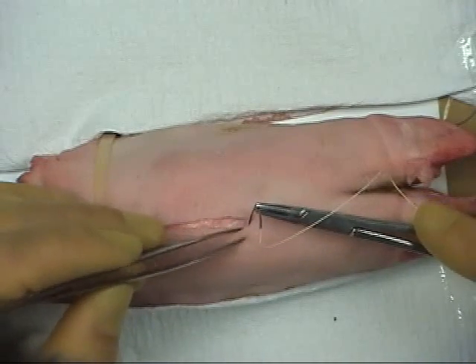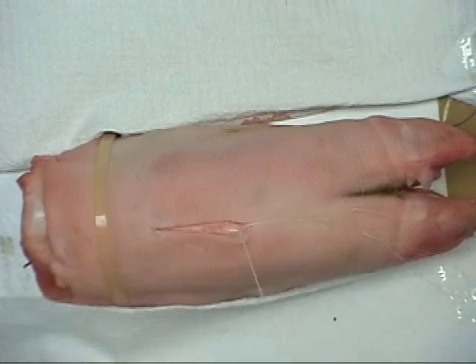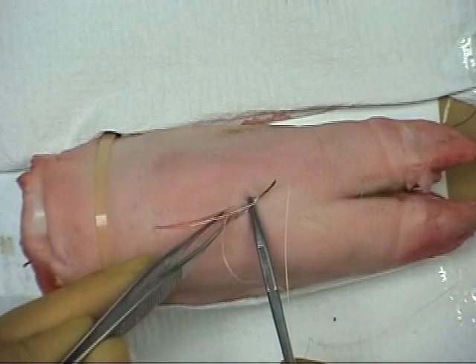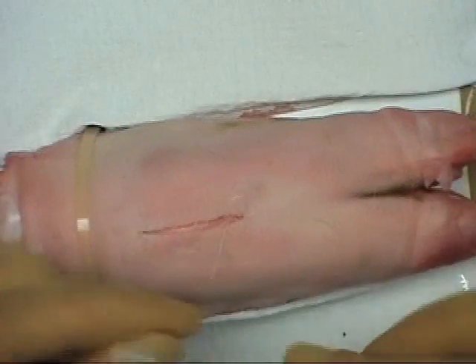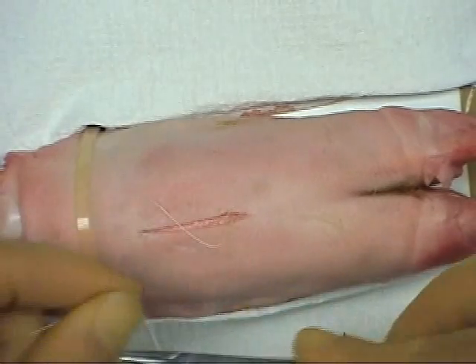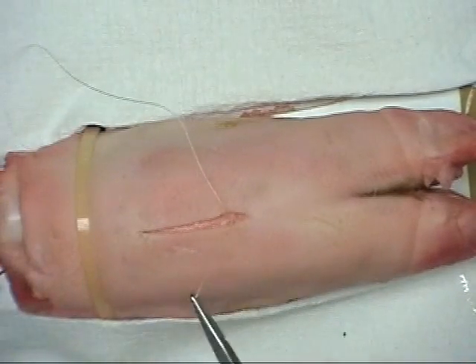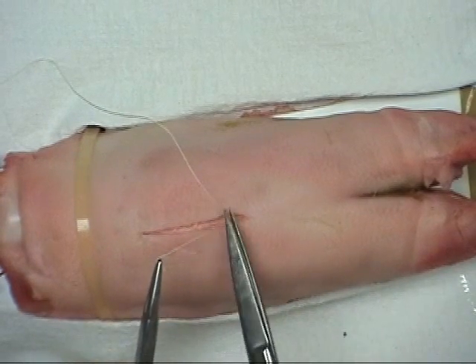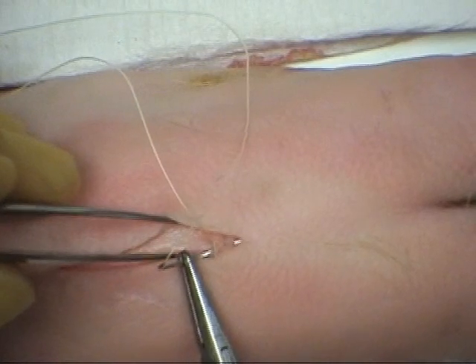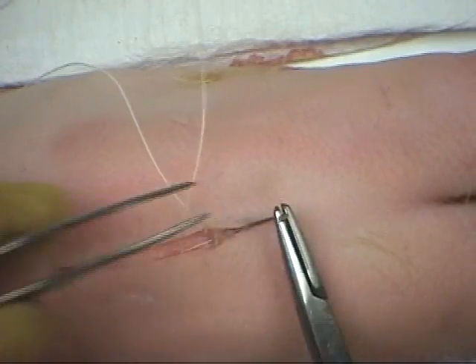The first bite is made deep and past superficial. Starting the bite on the opposite edge superficially, it is then passed deep. A reef knot is tied with just three throws to keep the suture material in the wound to a minimum. The tail should be divided as close to the knot as possible.